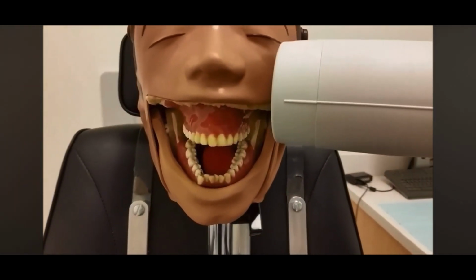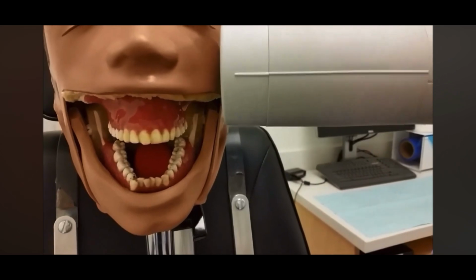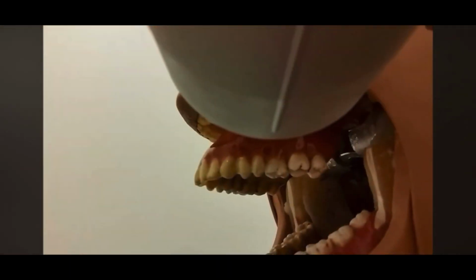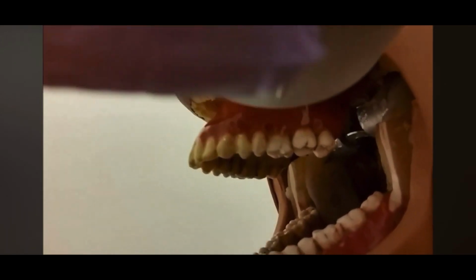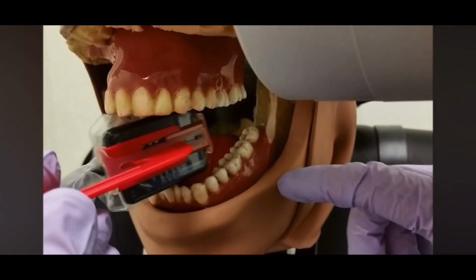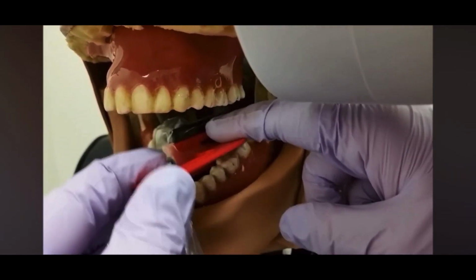For the molar view, I'm trying to open the contact between the first and the second molar. So I'm going to line my cone up with the second and first molar, using this line in my cone to aim for that first molar.